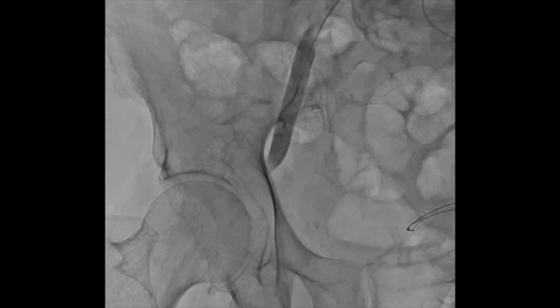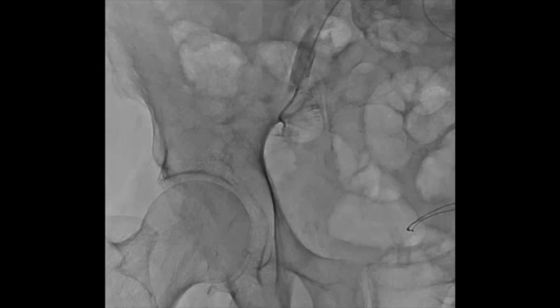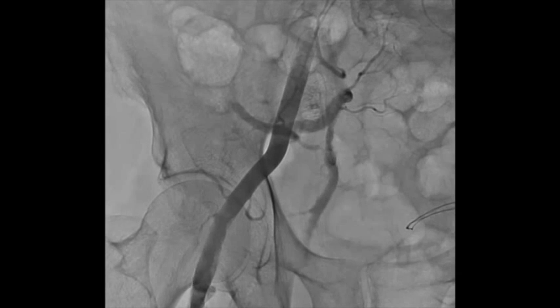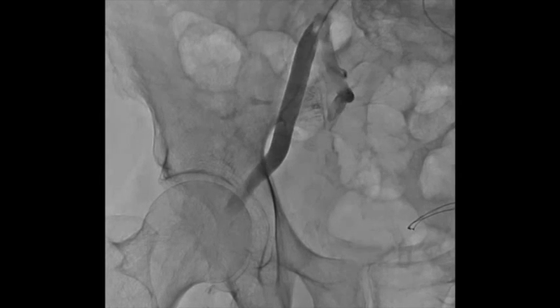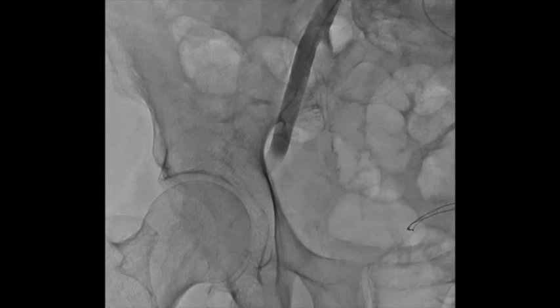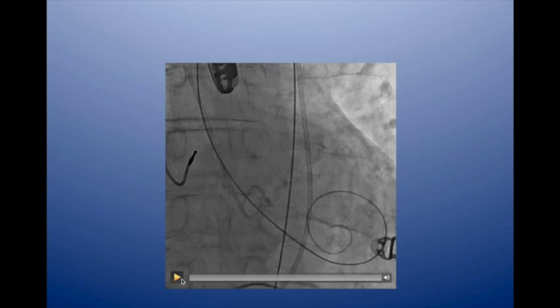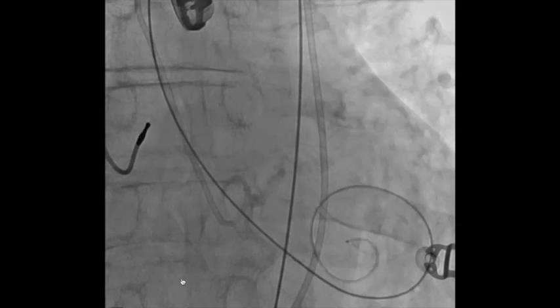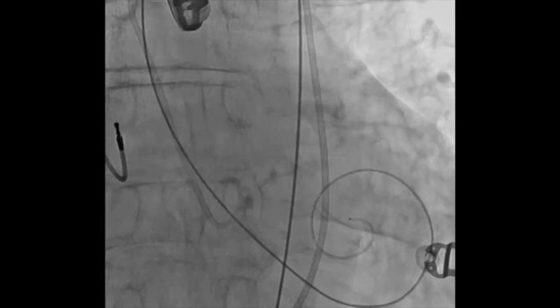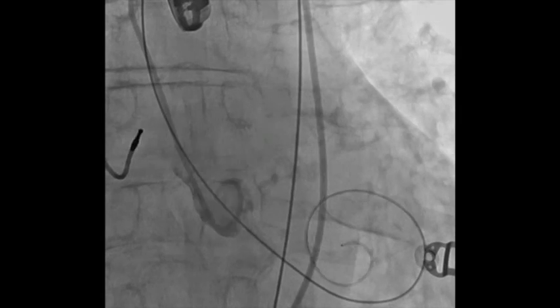We then cross the valve with a very stiff wire. We have a pigtail in the non-coronary sinus, which outlines the virtual ring. We need to see all three leaflets on the aortogram — the right coronary in the middle, the left up here, and the non-coronary on the left. With the pigtail in the non-coronary sinus, we know where the virtual annulus is and position the TAVI valve during the procedure based on this.